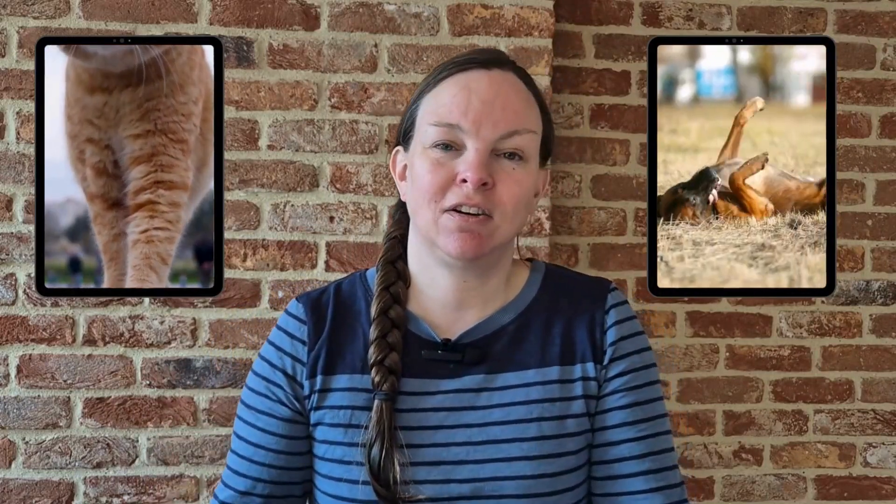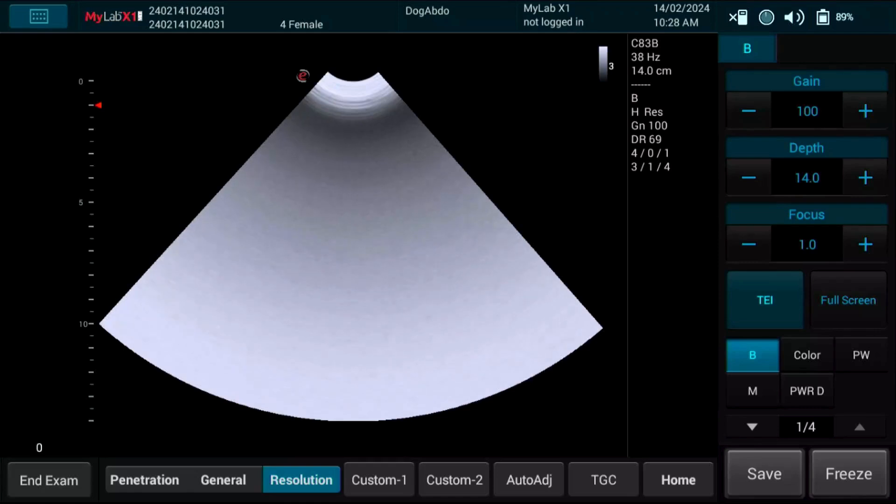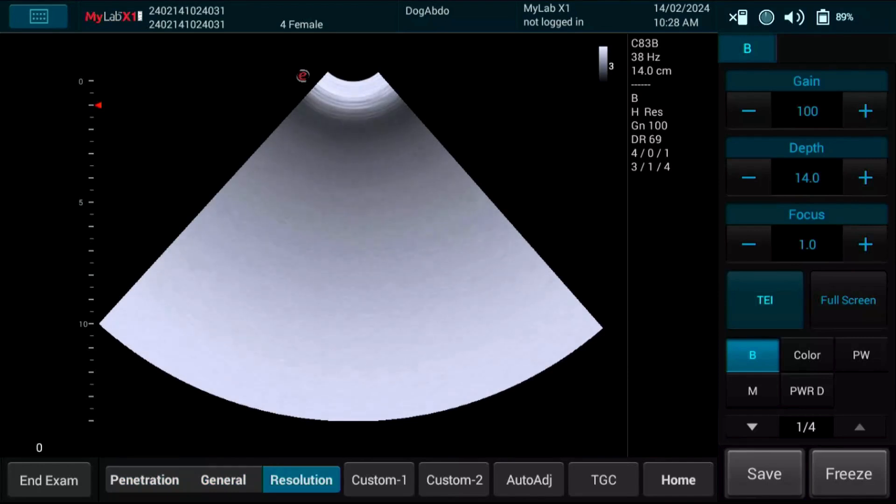In practice: use high frequency for superficial structures — cat abdomens, the bladder wall in small dogs, or even eyes. For low frequency, use it for deeper structures — the liver in a deep-chested dog or the kidneys in a large breed. Most probes let you toggle between frequency presets: 'res' for resolution or high frequency, 'gen' for general or mid-range, 'pen' for penetration or lower frequency. Other machines let you directly choose the megahertz: 5, 7.5, 10, etc. Use the highest frequency that still reaches your target. If your structure disappears into shadow or haze, drop it down a notch.